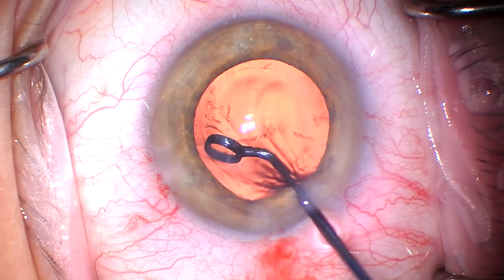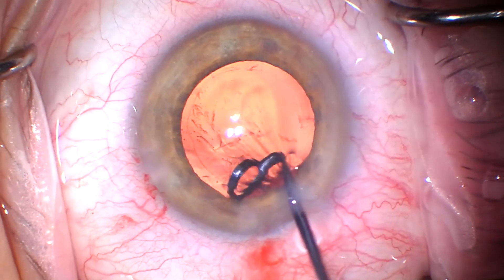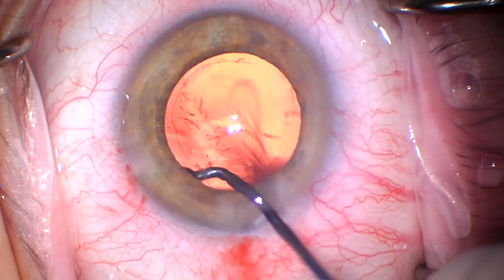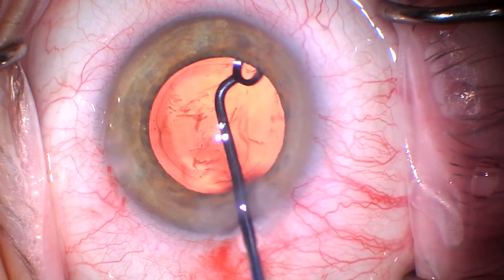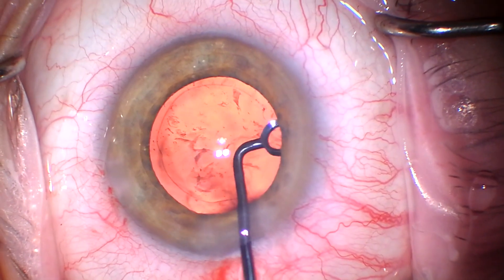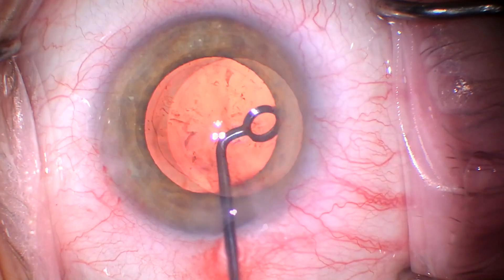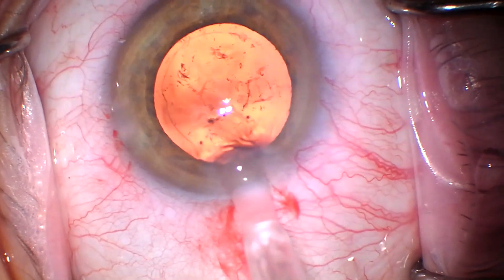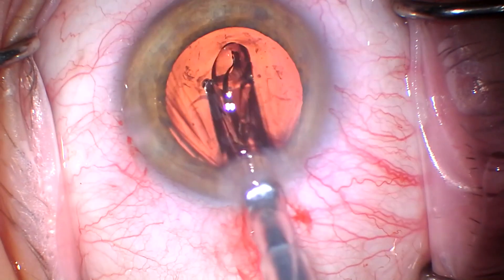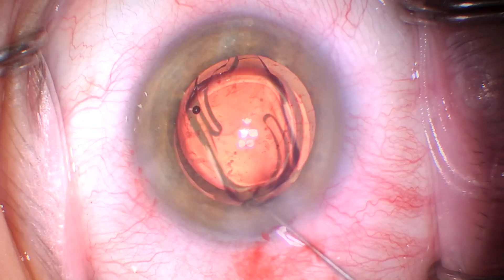There are several reasons to polish like this. One is you get a much quieter eye. It's debated and probably not really proven that it decreases PCO and YAG rates, but you get a much quieter eye. This is a post highly myopic LASIK eye with Ks of about 37. So even with all the good techniques for your measurement and IOL calcs, you have a risk of exchange. I think if you've got a polished capsule, you have an easier time if and when you have to do an IOL exchange.